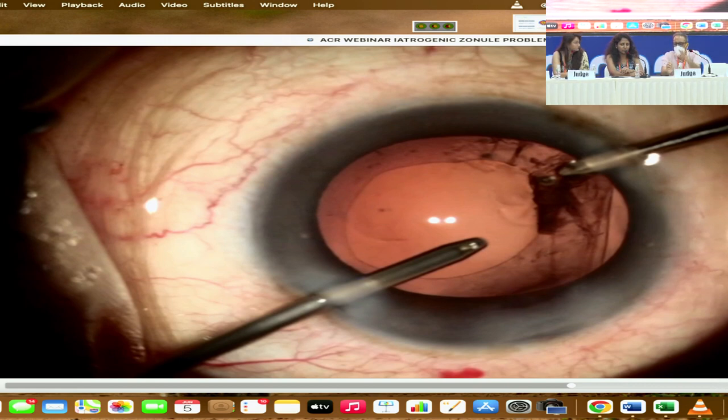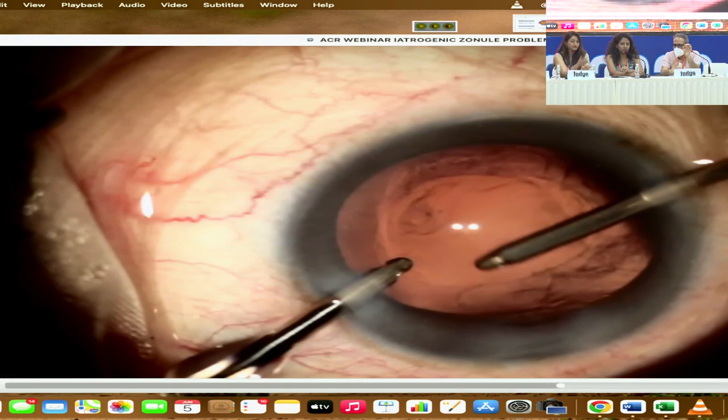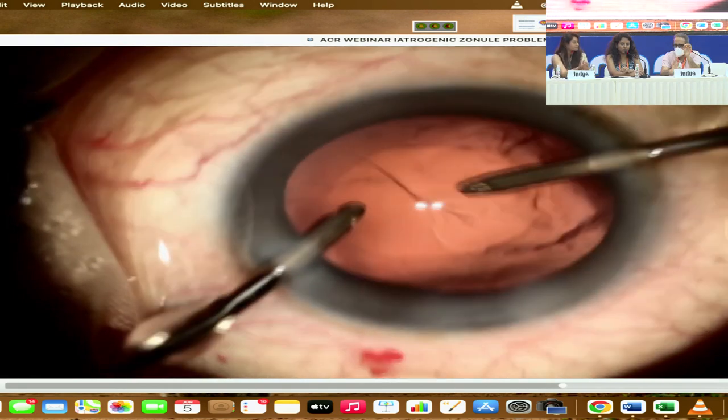That is the irrigation. That's another question, because the chamber should not collapse by any means. Can you just reflux it and go with the irrigation off, go close and dislodge it somehow? No, he has already dislodged it. Now he has to remove his aspiration port. And then what we were discussing is whether to inflate the bag. Do you prefer dispersive or cohesive?